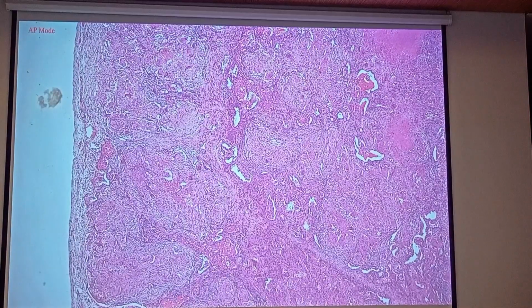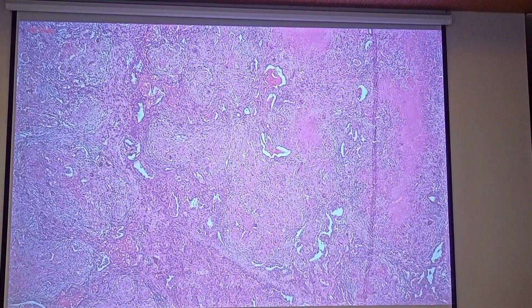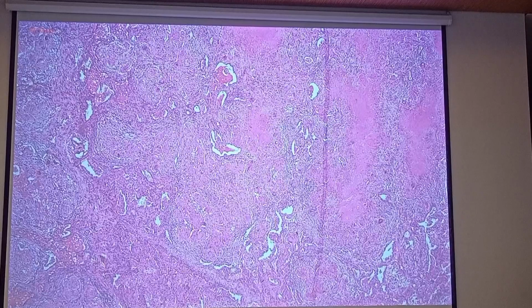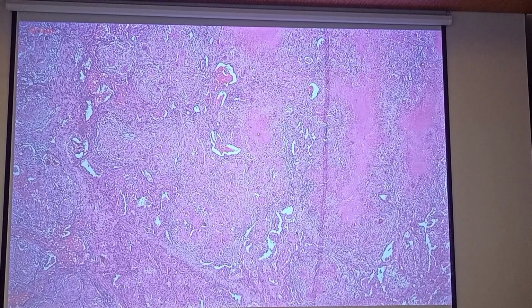So this is one granuloma right here, another one right here, another one right here. Occurring at different levels pa. So pag-cut mo, some parts are just portions of that granuloma, but some are actually cut through their center. You can see this and this. This one has a very large caseous necrosis right there.